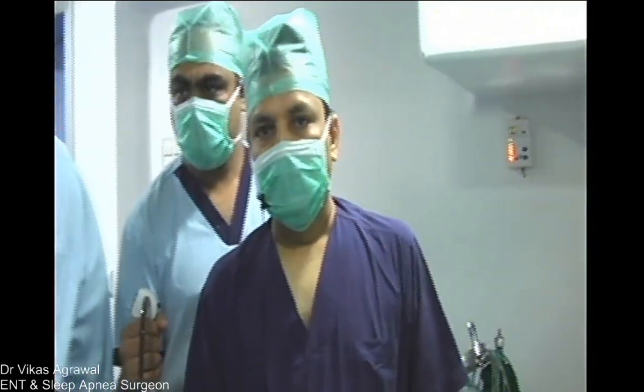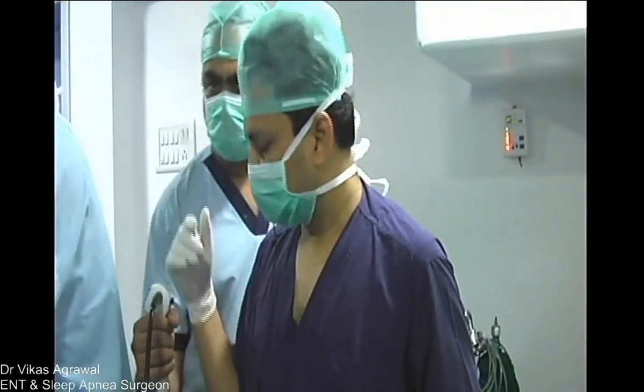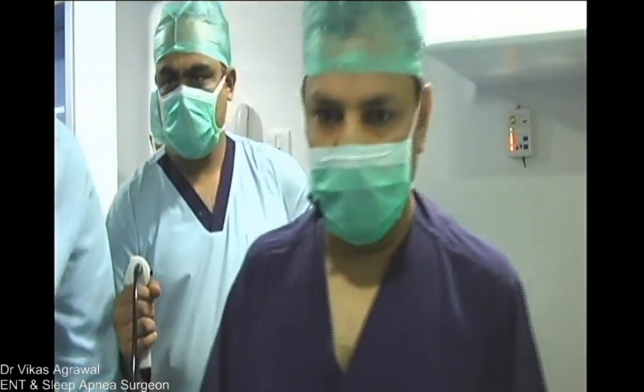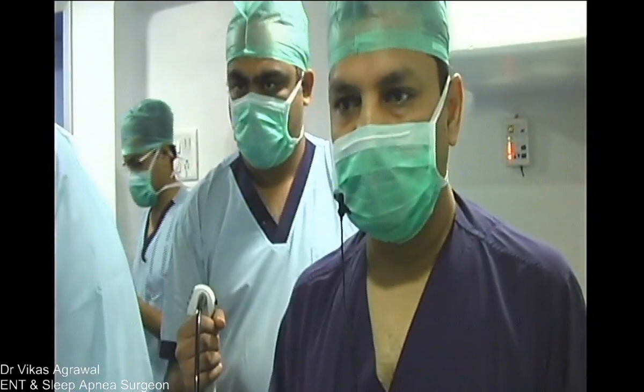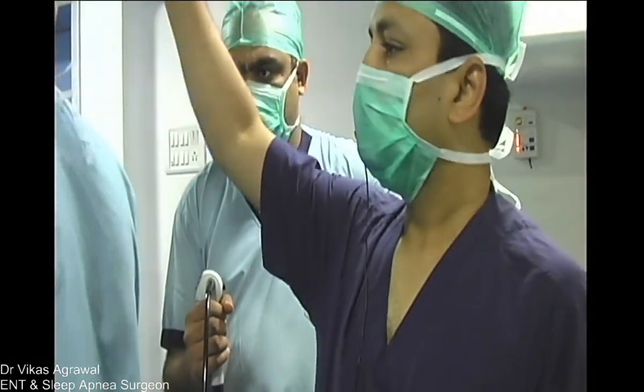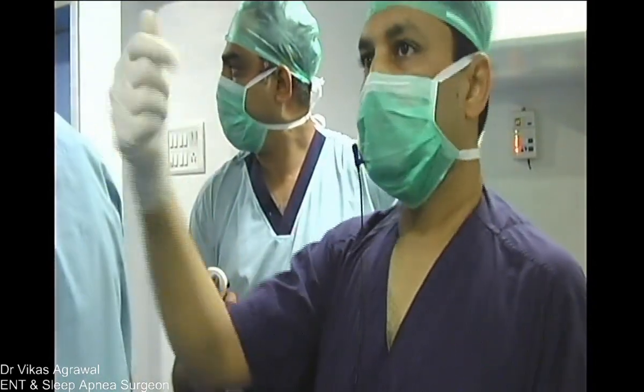Yeah. So, do we have questions from there? Now, so what is drug-induced sleep endoscopy? It will take around 5-7 minutes for Dr. Kalpesh to induce anesthesia, and definitely video laryngoscope.